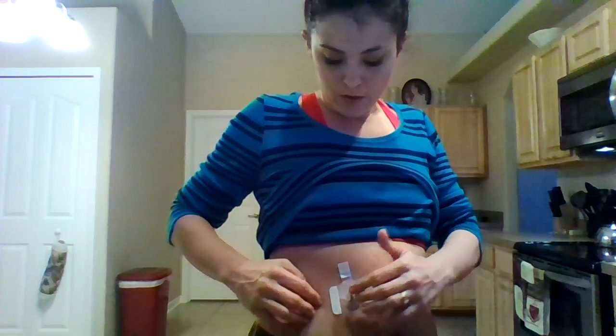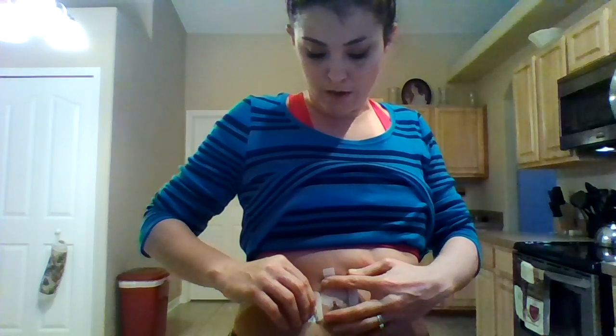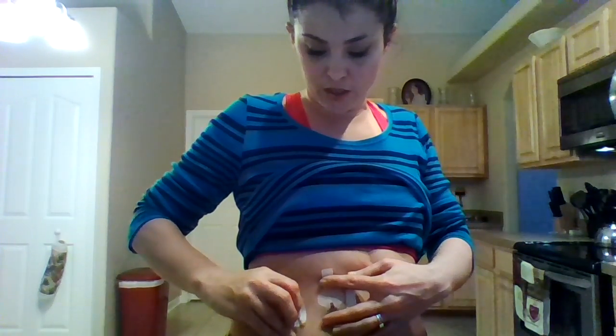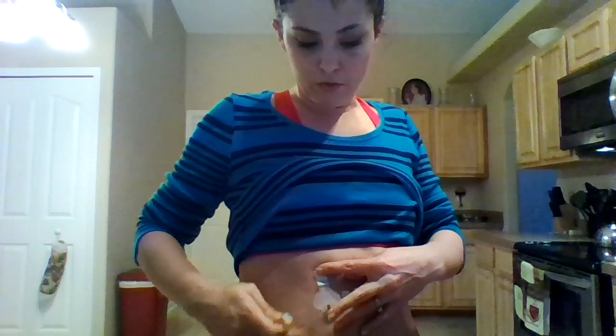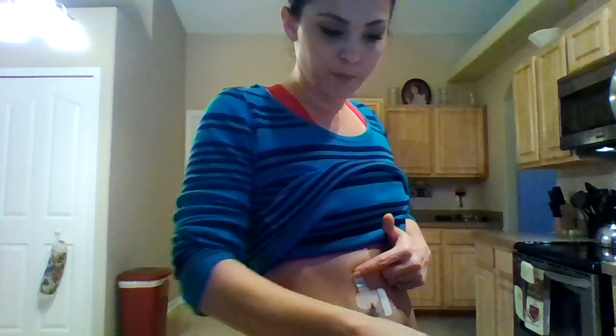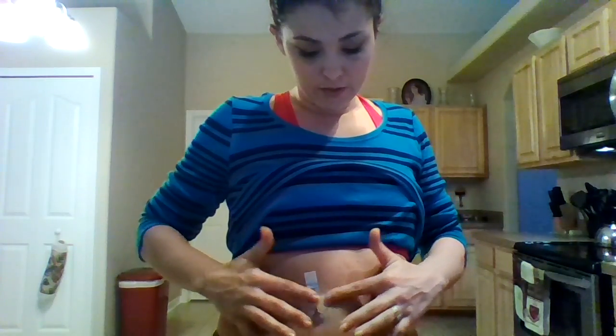And if it doesn't, I have some extra tape from some sensors that didn't work out so well. Medtronic is really good about it: if your sensors don't work, they will send you a replacement one as long as it's legit and you did what you were supposed to do. So right now, when you take the sensor off, there are these little tabs on each side that we didn't rip off yet. That's what I'm ripping off and just taping down. The thing with the over tape is that the more friction there is, the better it sticks. So I just rub it for a few seconds.